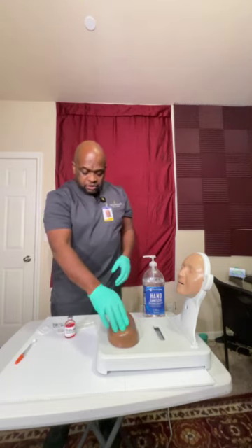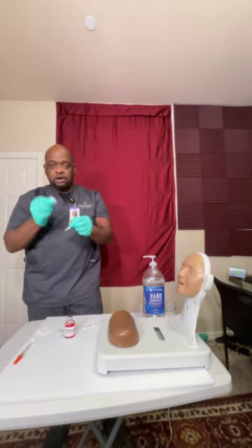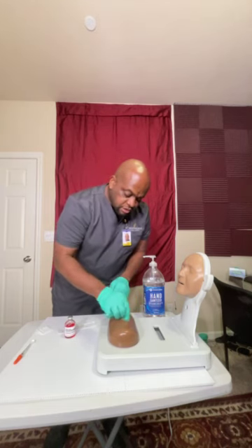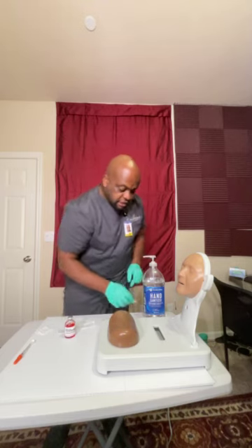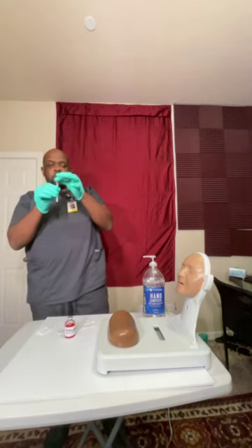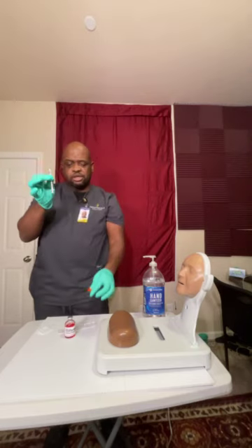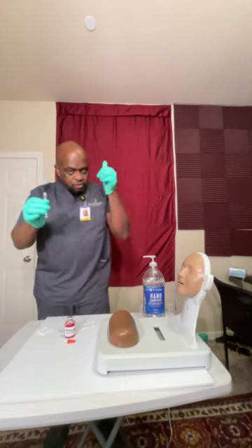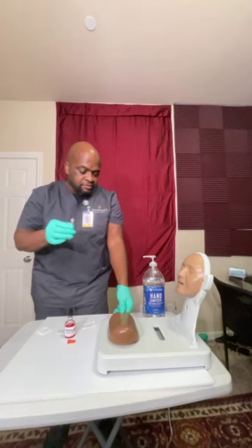So now that I found the spot, I'm going to clean that area with alcohol, right? Using a circular motion, 2 centimeters, working my way out in a circular motion. That's clean. I'm going to let that dry on its own. Now I'm going to hold the syringe with my index finger and thumb, making sure that the bevel is up. This is with my dominant hand. Now with my non-dominant hand, I'm going to pull the skin tight.